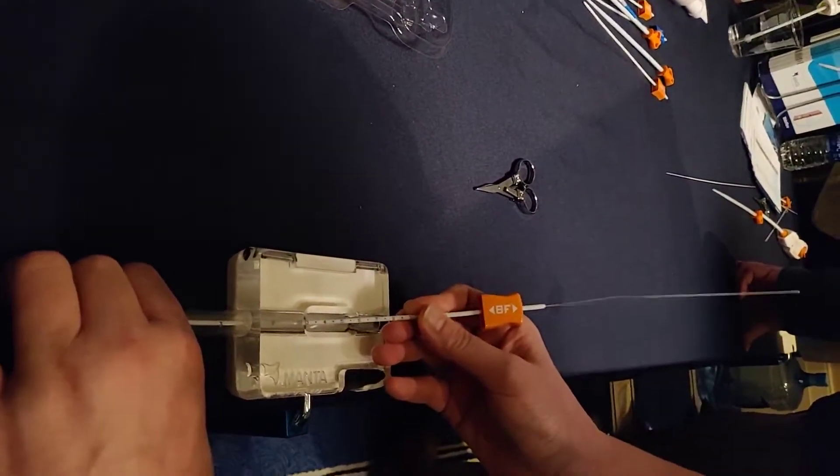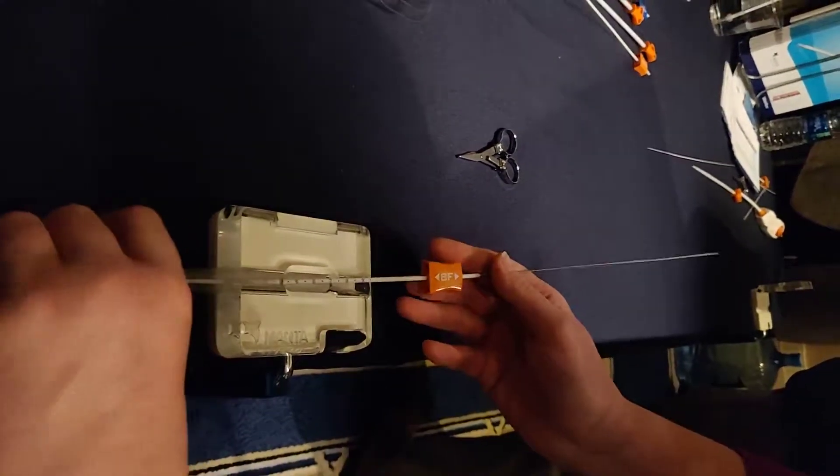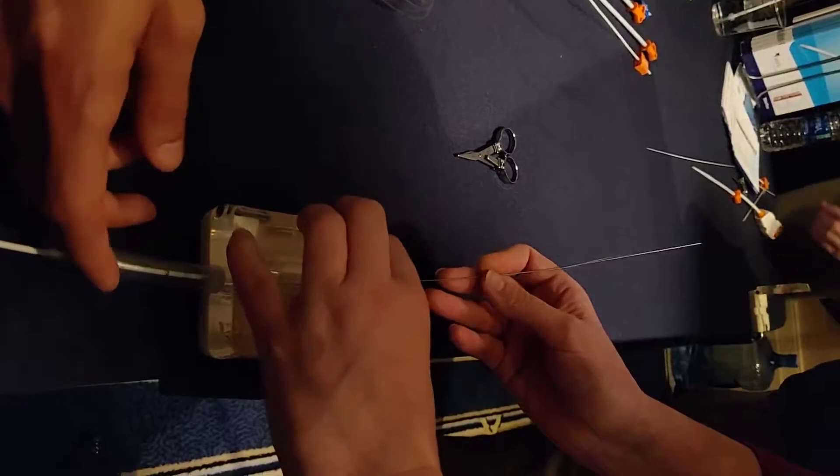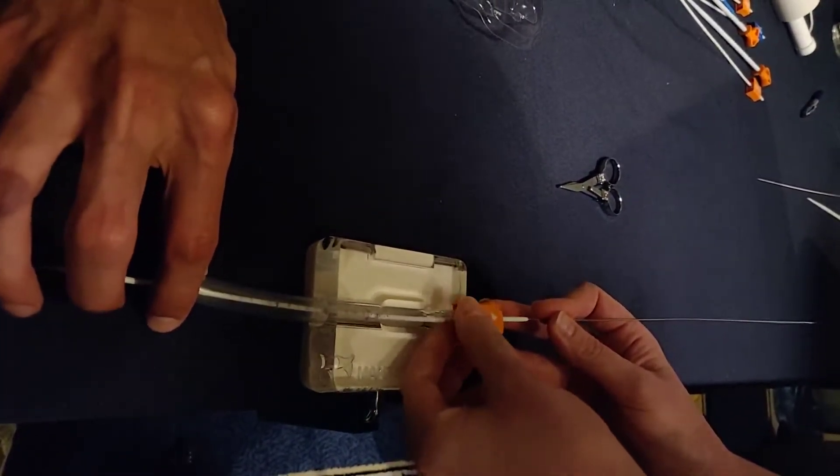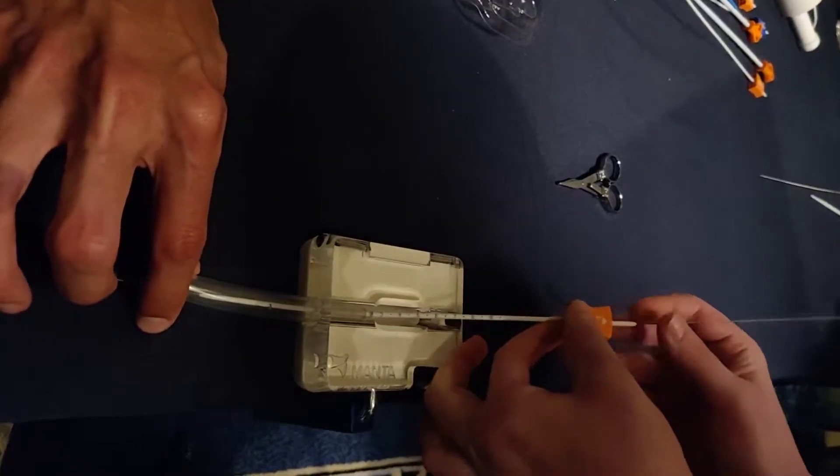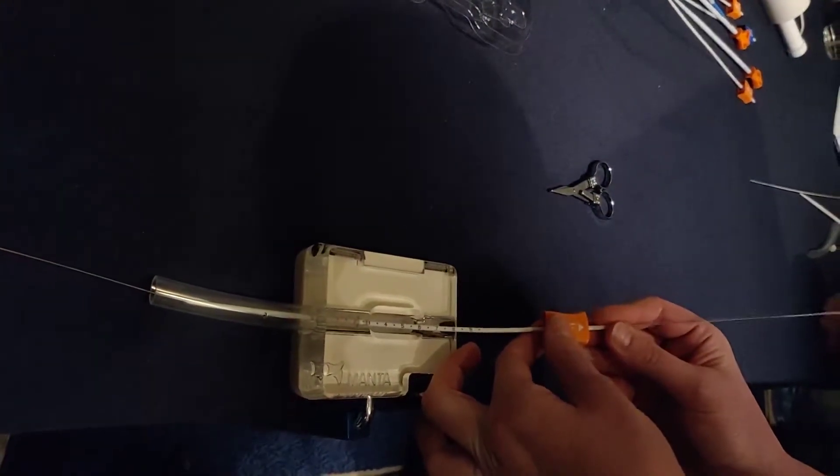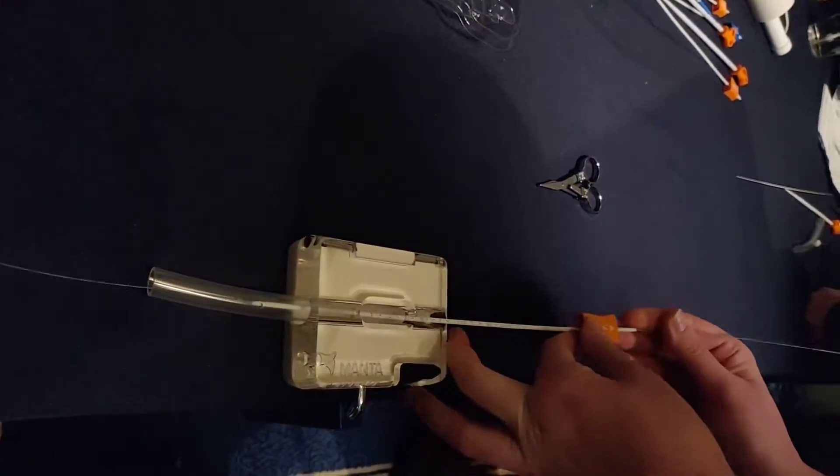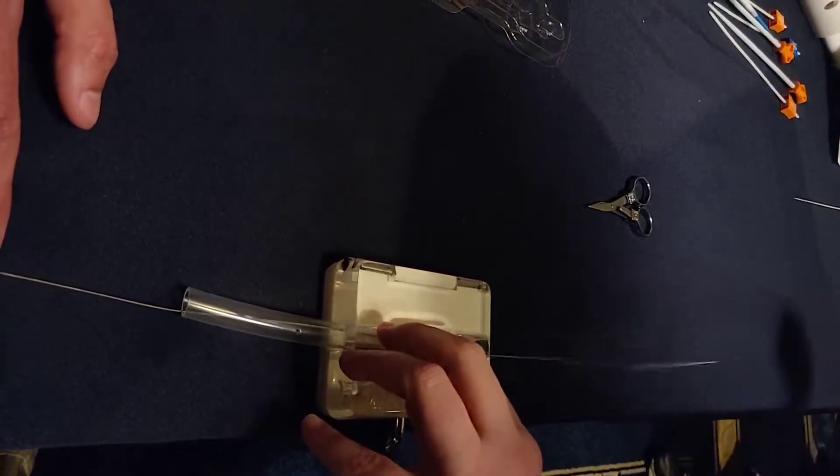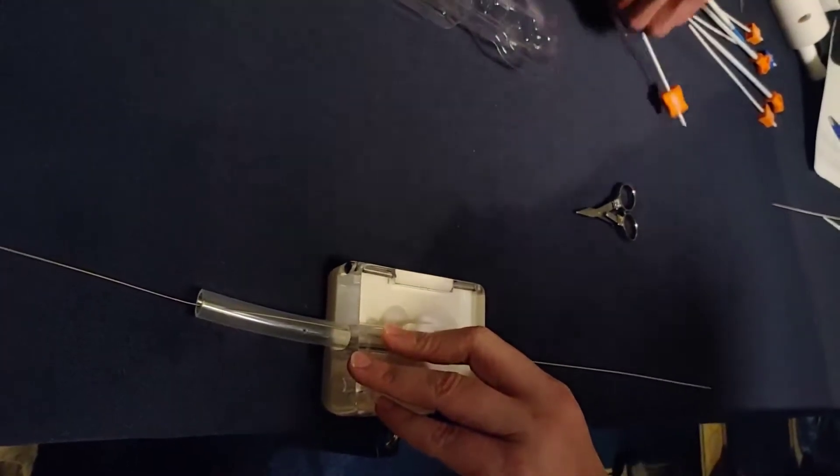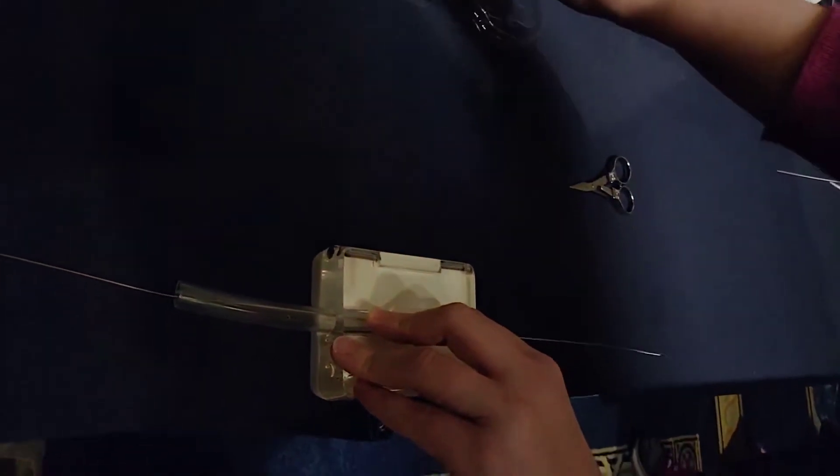This is for measurement, yes. You'll get that bleed back. We're gonna pull this back all the way and then let's do three. Perfect, three plus one, four. Nicely done. We always check twice, but you know your discretion. Yep, so nicely done.